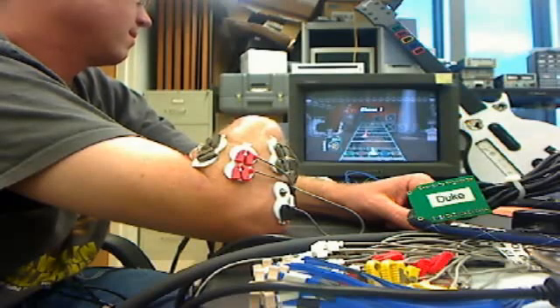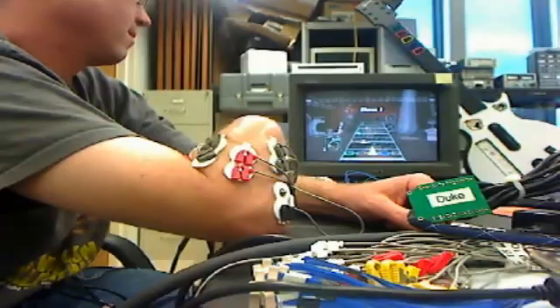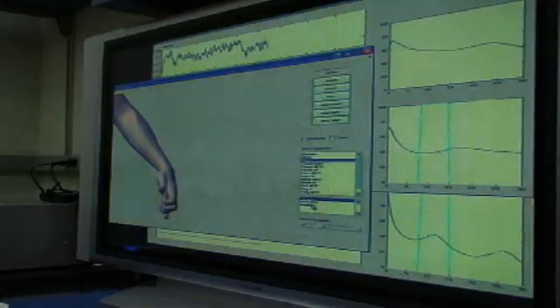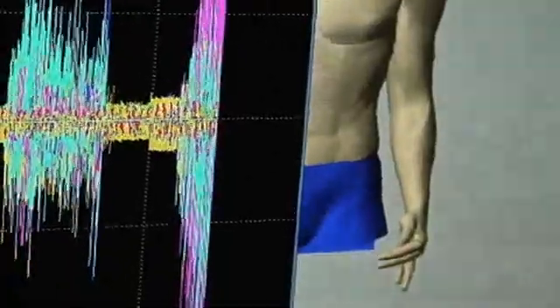Here's how it works. He flexes the muscles he associates with opening or closing different fingers. The electrodes taped to his forearm pick up electrical signals from those residual muscles. Those signals are processed to map the muscle contractions to his intent.